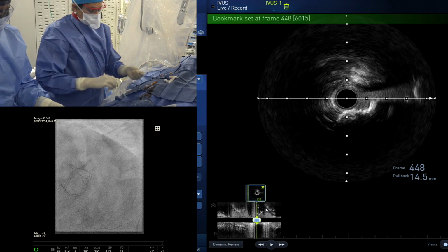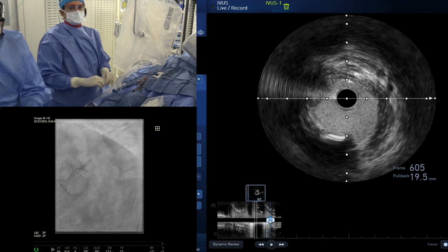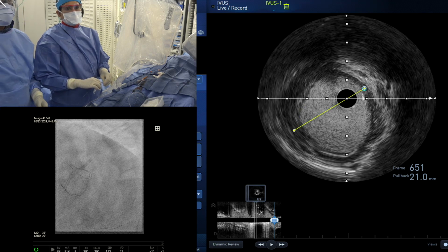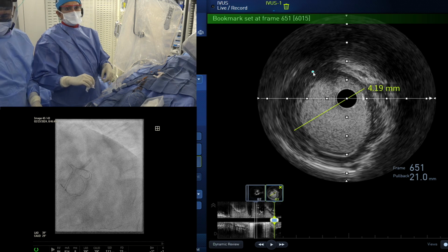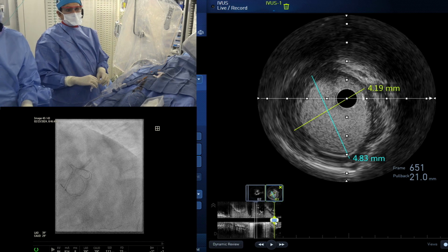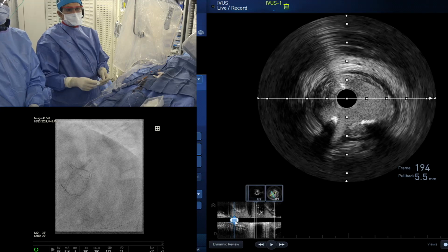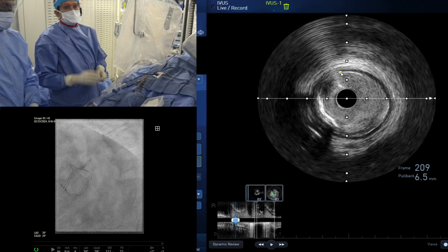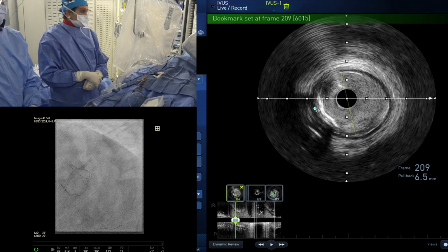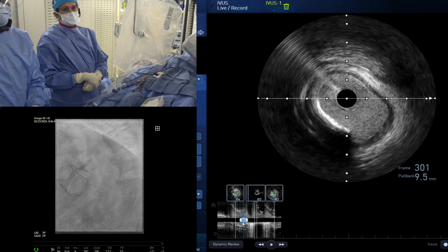How much is the diameter of the left main and the LCX ostium or proximal LCX? Now I try to find a healthier left main. I check the EEL to EEL, like a reference vessel, in cross section. It is going to be 4.5. This is the proximal left main, the healthy part. Now come to the distal circ, after the lesion, before the branch. Not the perfect healthy part, but the vessel size by EEL is like 3.5. The proximal circ is a 3.5 vessel. At the ostial circ we need... yeah, ostial circ, sure. Okay, now Bhupati has some question also.